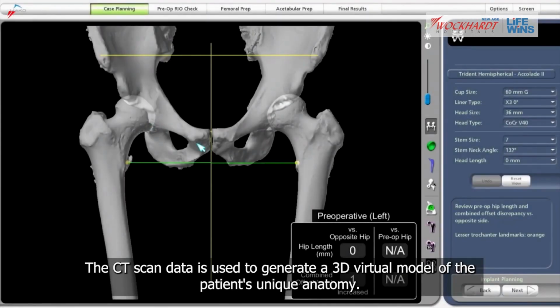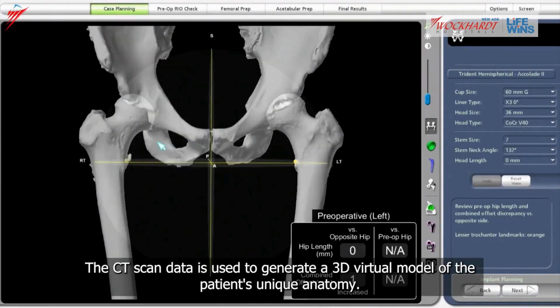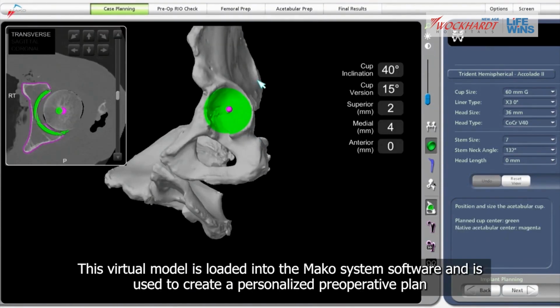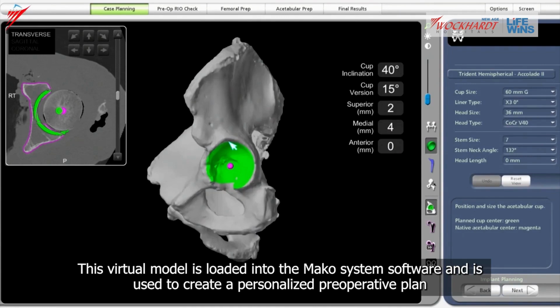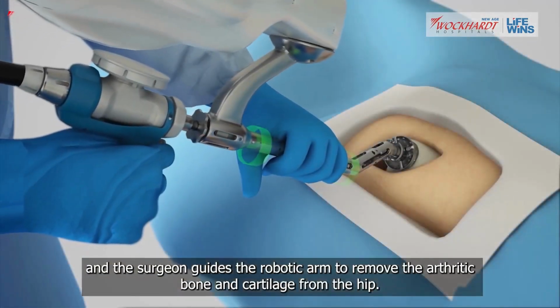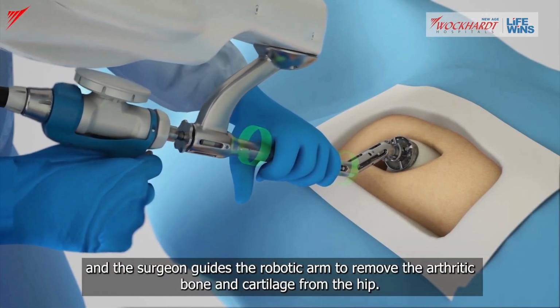The CT scan data is used to generate a 3D virtual model of the patient's unique anatomy. This virtual model is loaded into the Mako system software and is used to create a personalized preoperative plan. And the surgeon guides the robotic arm to remove the arthritic bone and cartilage from the hip.